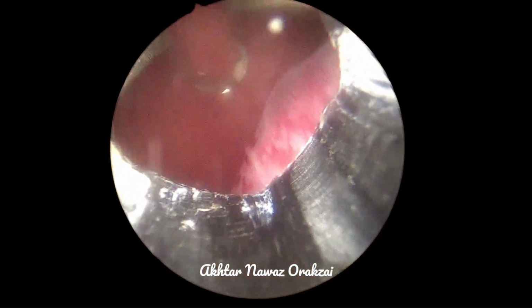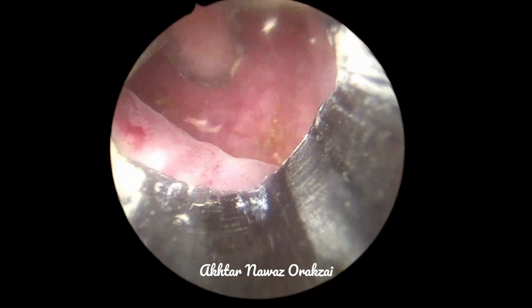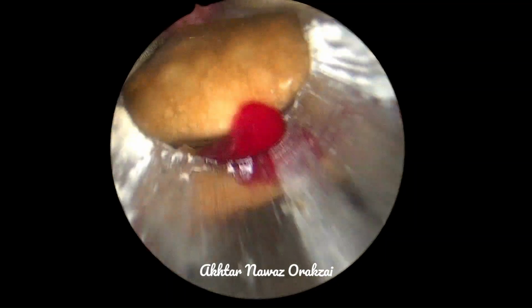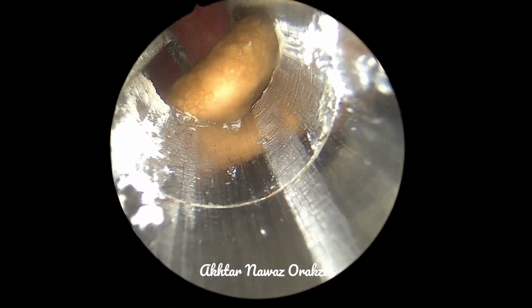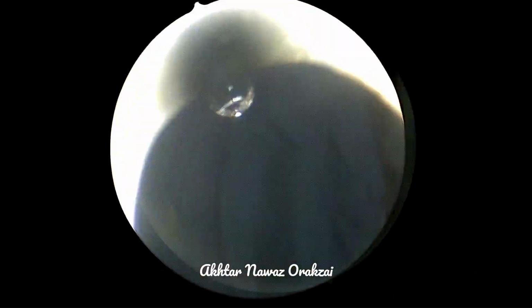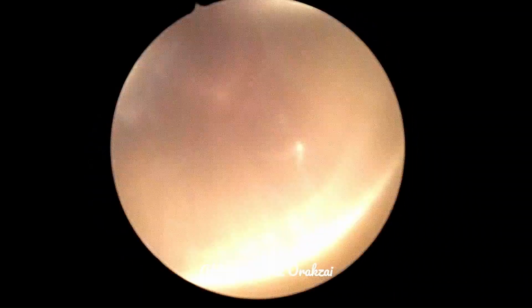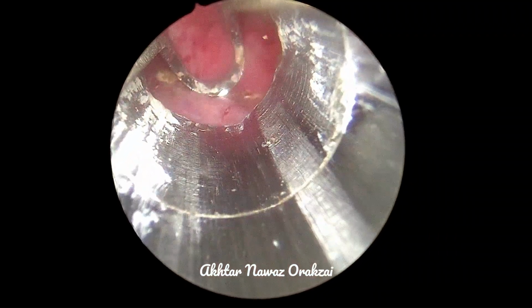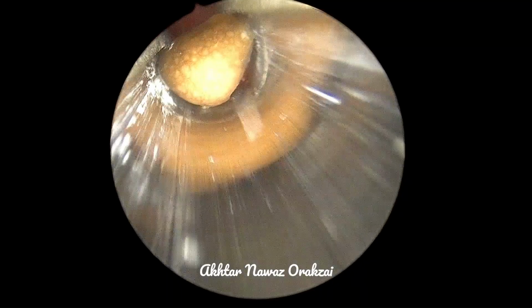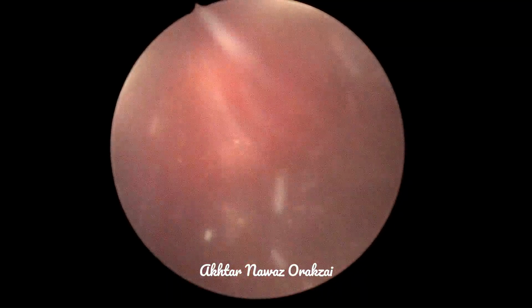There is no significant bleed, because when we realized that we had taken mucosa along with the stone, we just released the stone as well as the mucosa. So the stones are hiding behind the huge median lobe.